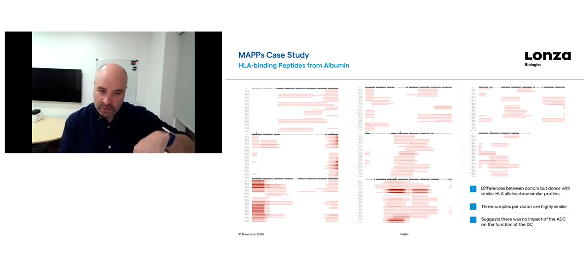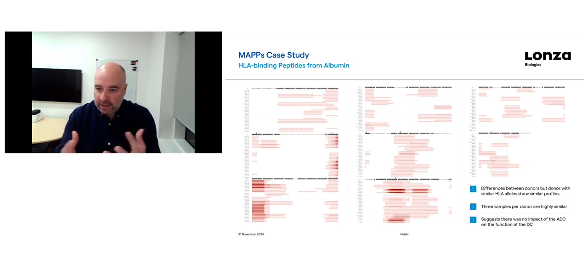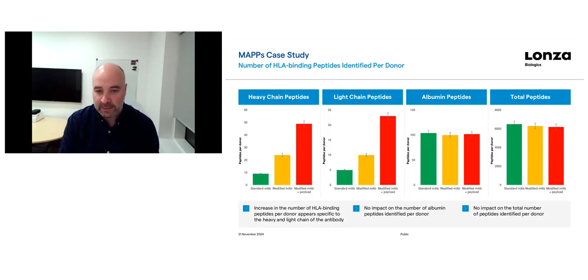And obviously here we have many more rows, because we appreciate you probably can't see all these different rows. These are the 10 donors and the 3 conditions, the 3 antibody treatments per donor. If you look at the pattern of responses, it doesn't matter which bit of the sequence you look at, you can see they come in kind of triplicates. So you see very reproducible responses within the donors, especially if you look at the bottom of the middle section, where you'll see 2 very red areas in particular, and that's in the same donor. So what we see here is the donor variability based on their HLA, but the technical variability is very tight. We see even the same numbers of peptides across the same area. So this gave us a good indication that it's not necessarily every protein in there that's interacting with the dendritic cells, that we're seeing a general increase when we add the ADC compared to the naked antibody.